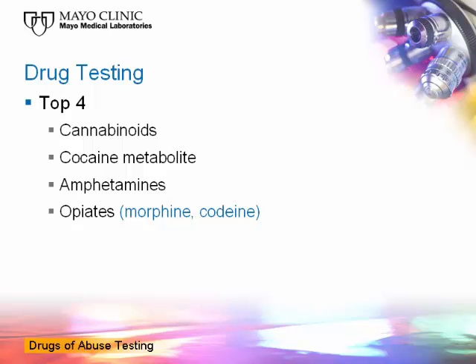Now, when we have drug testing, the top 4 requests that a laboratory typically gets are cannabinoids, which is marijuana, cocaine and its metabolite, amphetamine-type stimulants, and opiates.